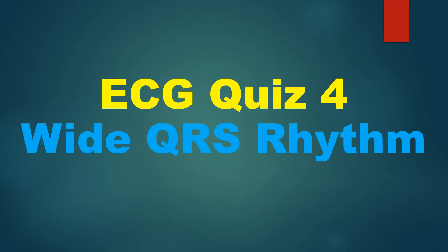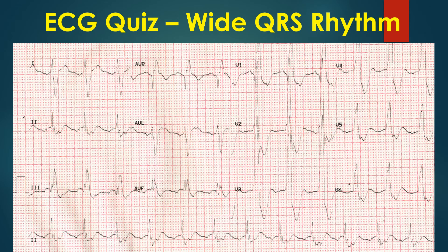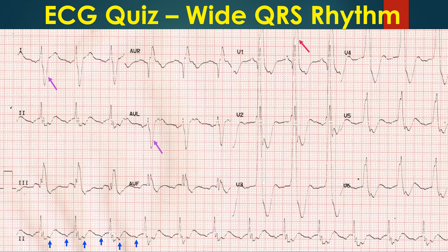ECG quiz on a wide QRS rhythm. Here is an ECG showing a wide QRS rhythm — what are the findings and interpretations? P-waves can be seen at a rate double that of QRS complexes, marked by blue arrows in the rhythm strip. They are inverted in inferior leads, indicating an ectopic focus from the low atrium, suggesting an ectopic atrial tachycardia.